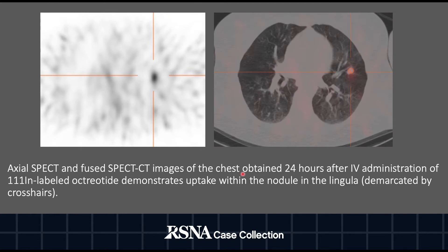Here we have axial SPECT and fused SPECT/CT imaging of the chest obtained 24 hours after IV administration of 111 indium-labelled octreotide, which demonstrates uptake within the nodule in the lingula, shown here on the unfused and here on the fused images.